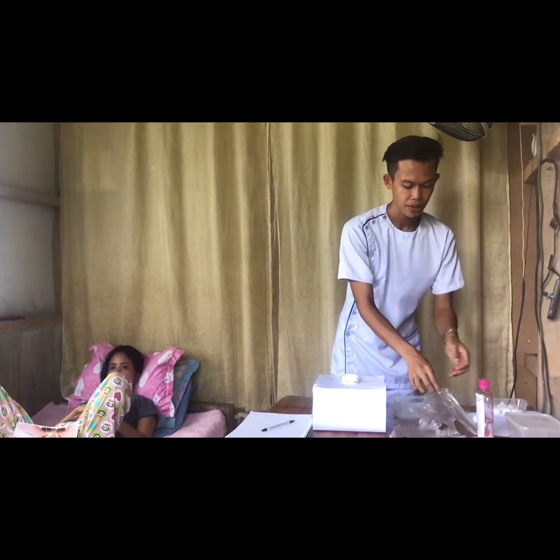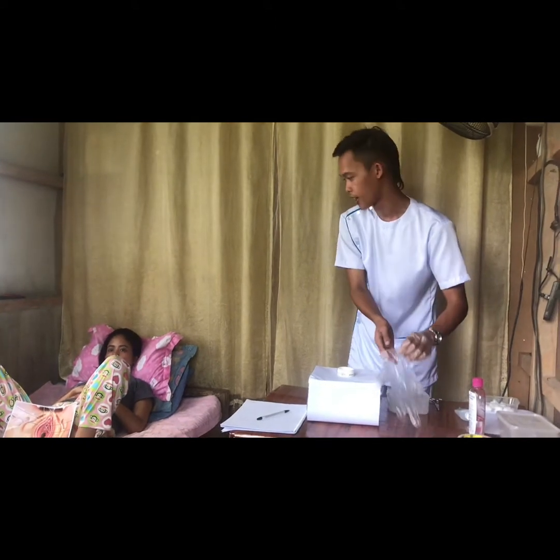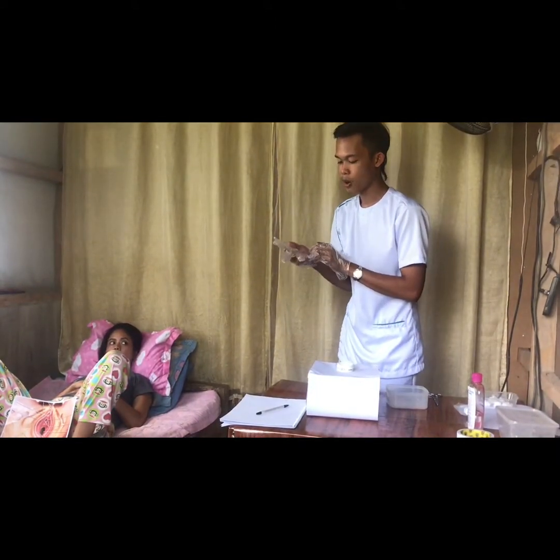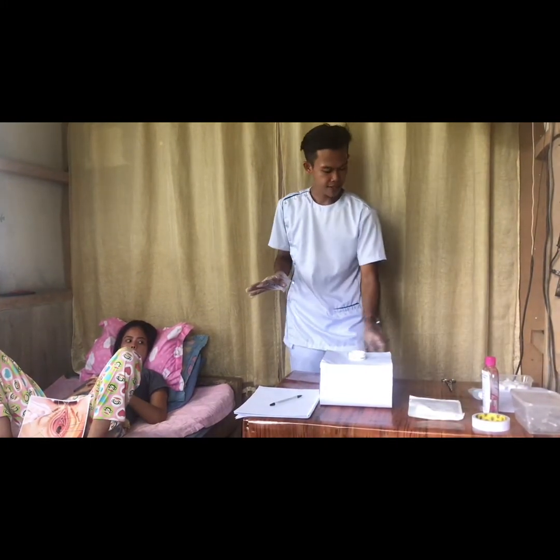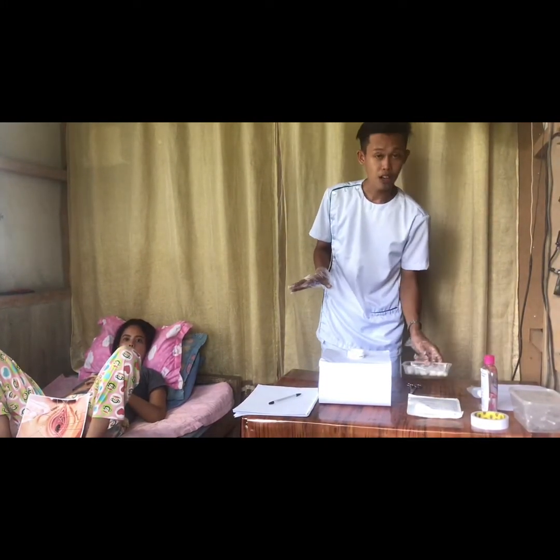So the next thing that we're going to do is to put on the working gloves. So ma'am, I'm just wearing my working gloves, okay? Because I am going to do pericare, okay? So the pericare itself has two reasons. First is for inspection. At the same time, this is to cleanse the portions of the private part of the patient.